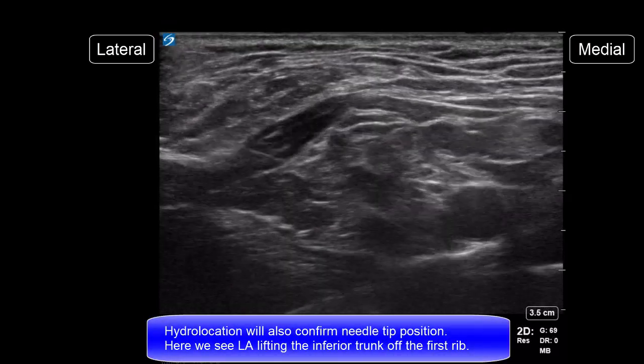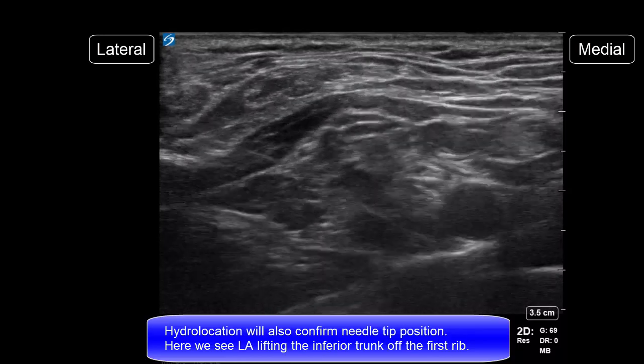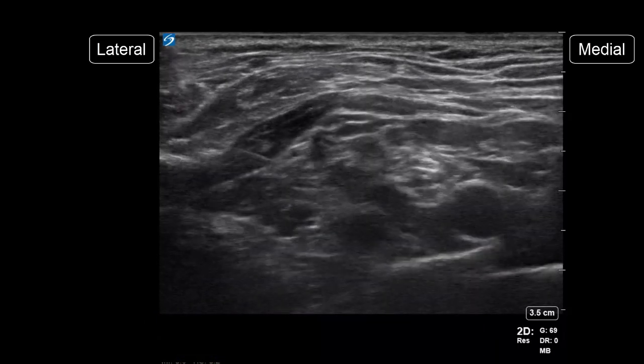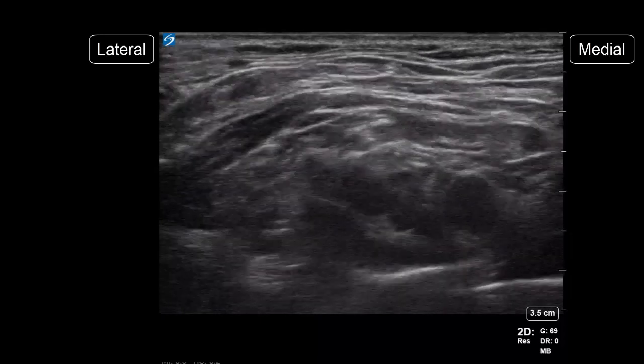Hydrolocation by injecting local anesthetic boluses will confirm needle tip position. Here we can see local anesthetic starting to lift the inferior trunk off the first rib. Two-thirds of the total volume of local anesthetic is generally deposited here.